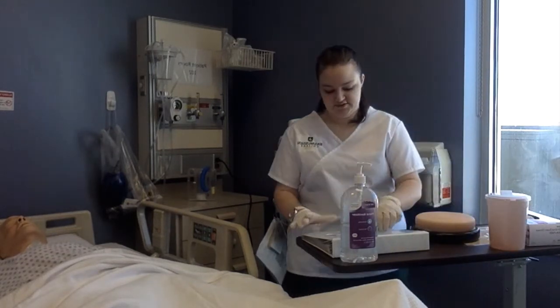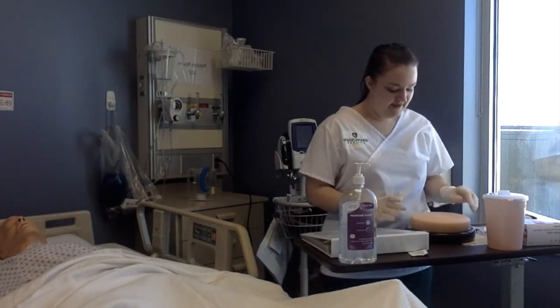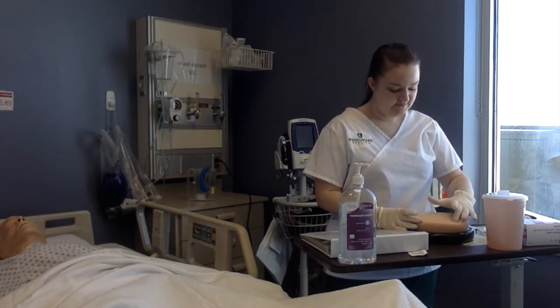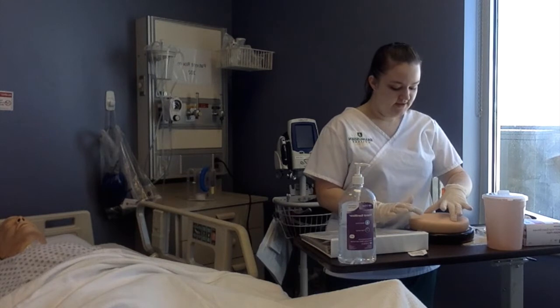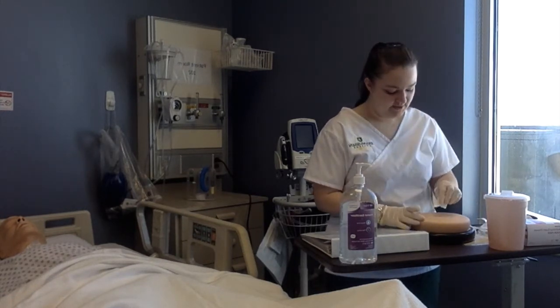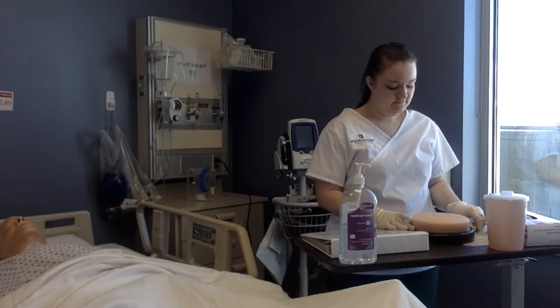Injection today in your dorsogluteal, which is the back of the hip. To begin, I will find your 3 landmarks. It will be posterior superior iliac spine, your greater trochanter, and your sciatic nerve. First, I will swab the site after I found the landmarks. I will let it dry without fanning or blowing on it.